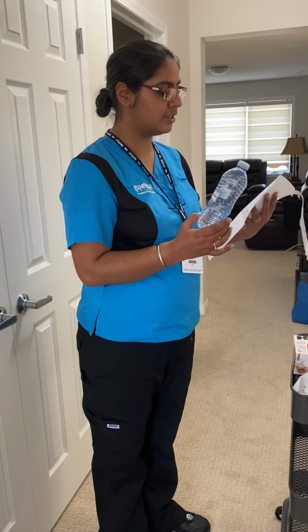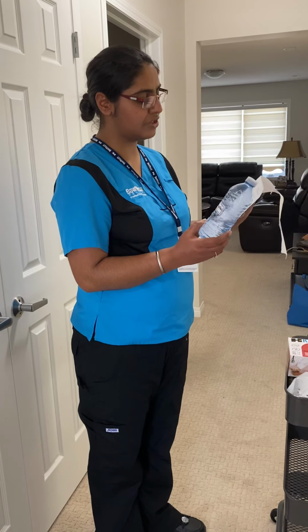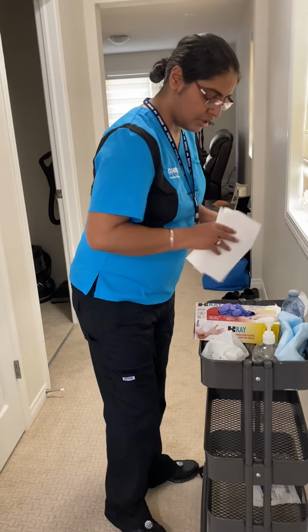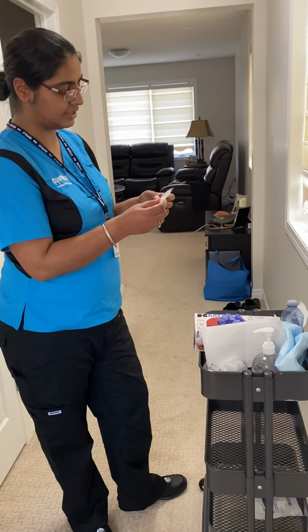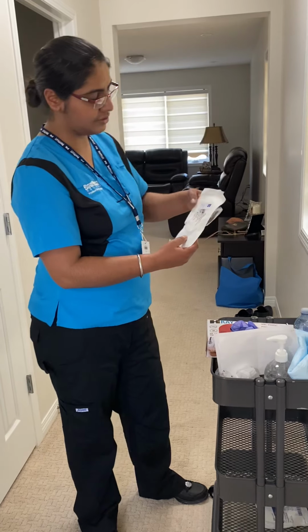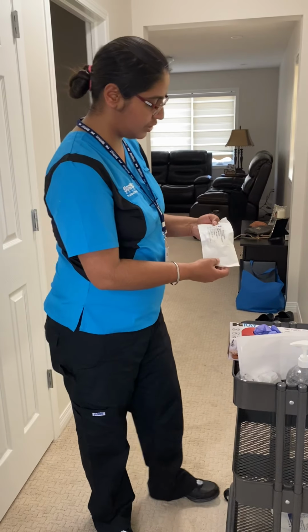First check: Smith Shirley, normal saline, 20 December 2021. Second check: Smith Shirley, normal saline, 20 December 2021. Third check: Smith Shirley, normal saline, expiry date 20 December 2021. So this is good to go. Now I have my steri strips. It is intact, dry and not ripped, and expiry date 20 December 2021. And my staple removal kit, it is intact, dry and not ripped, and expiry date 3 July 2022.